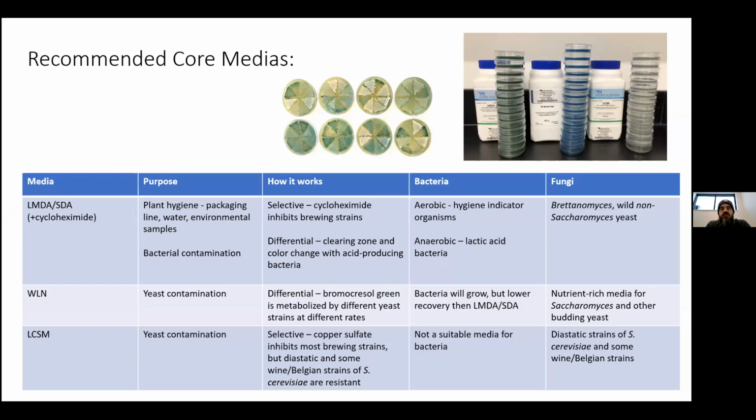So it's really a good media to detect a lot of different organisms. You can use it both aerobically or anaerobically to favor the growth of certain organisms. As I've already mentioned, talked a lot about WLN. Very good for just checking your cultures to see if you have mixed culture or if you have a pure culture.